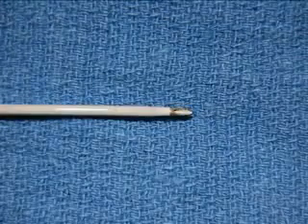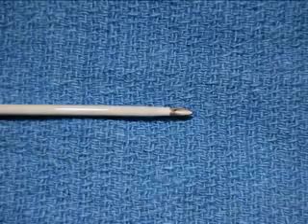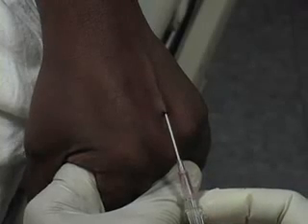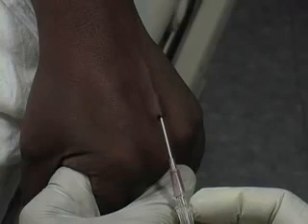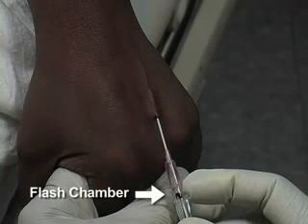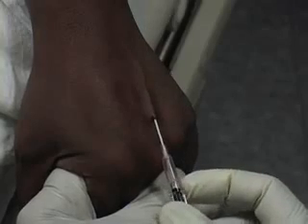Identify the beveled side of the needle. The bevel should face upward, away from the patient's skin, when the needle and catheter are inserted. While applying tension to the skin, gently insert the needle and catheter into the dorsal surface of the hand at a 30 to 45 degree angle. Advance the catheter slowly into the vein, watching at all times for a flash of blood. When the flash occurs, decrease the angle of the catheter. Advance the needle and catheter together approximately one half centimeter.